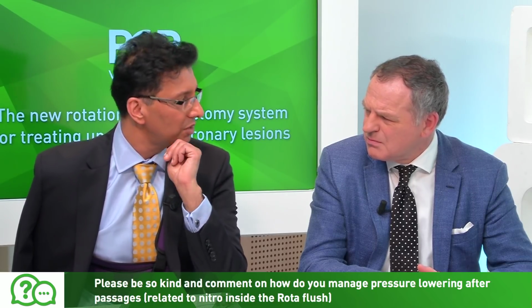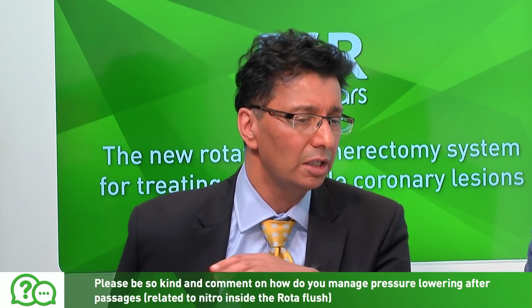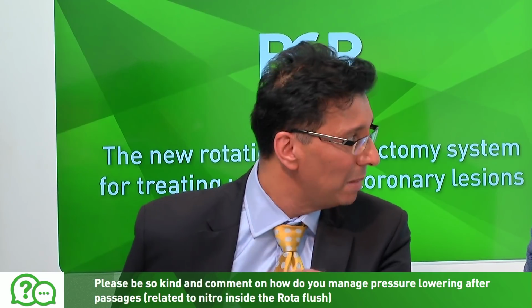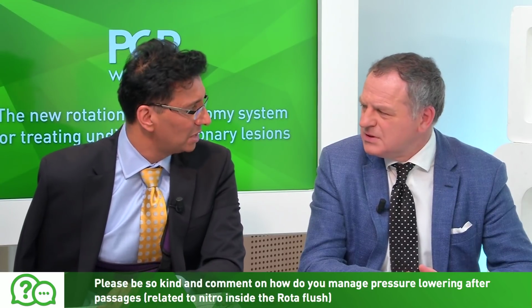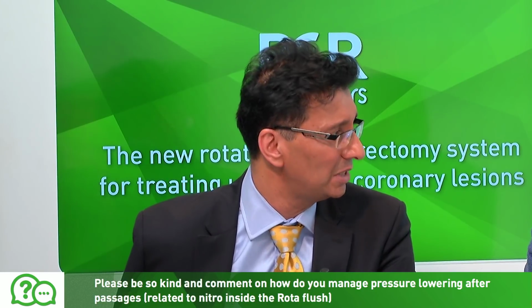So those are the steps that I would take, and sometimes I will even just switch off the flush in between runs if I think there's a systemic effect from the actual infusate. But you've got to remember to switch it back on, and that's why I think control from the table is important. So I always turn a stopcock myself, so that we can't blame a nurse or a technician for that, which is a potential.